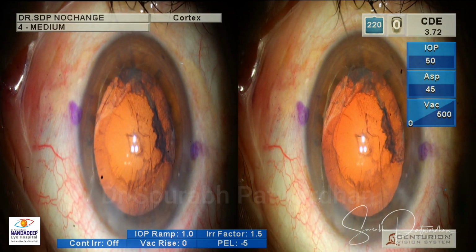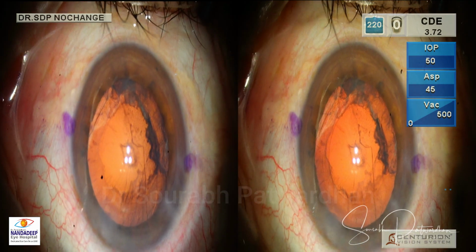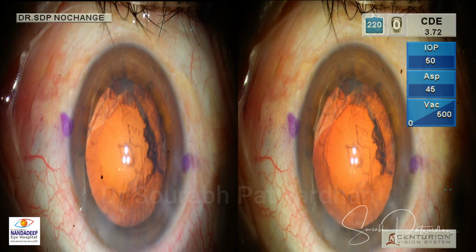Now we'll go to the cortex aspiration. Next patient is ready, no? Okay.